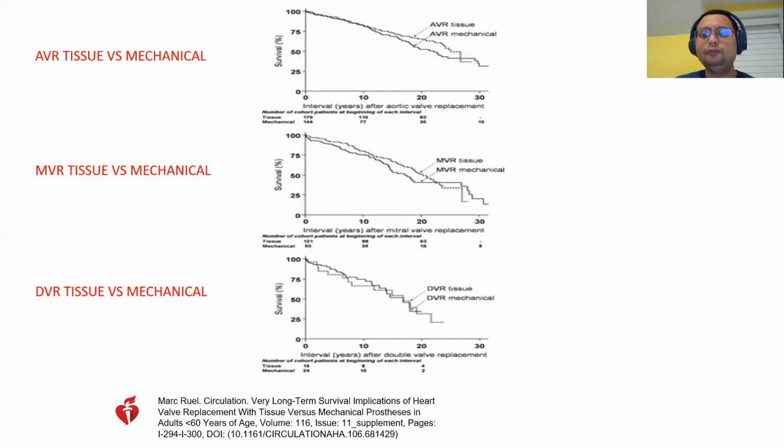Okay. What about if it's AVR versus MVR, or MVR versus DVR, tissue versus mechanical? It is exactly the same. You can see here, AVR tissue versus mechanical is the same. MVR tissue versus mechanical is the same. Even if you do both, so dual valve replacement, it is the same survival penalty.